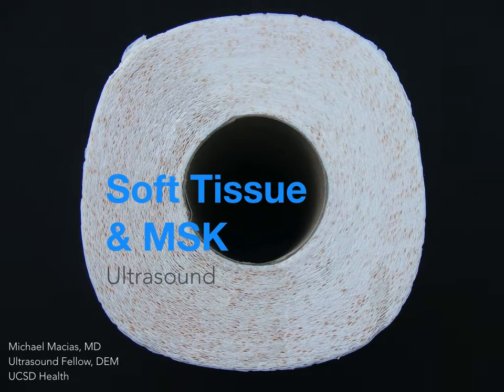Even better, as compared to static imaging such as X-ray or CT, ultrasound provides us with dynamic views of what's going on below the skin, whether it's assessing a ligament, performing a reduction of a shoulder, or aspirating a joint. Ultrasound is a real-time aid to assist with your clinical practice.